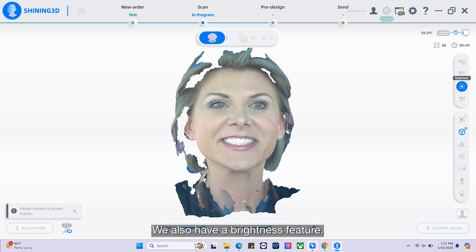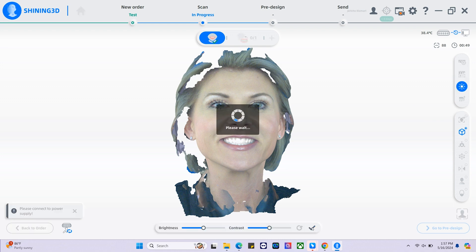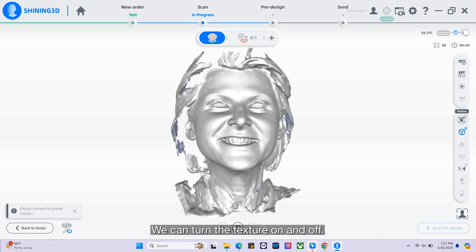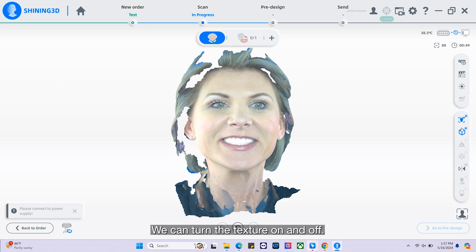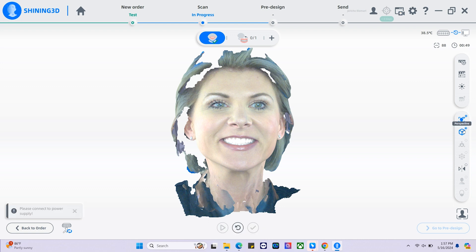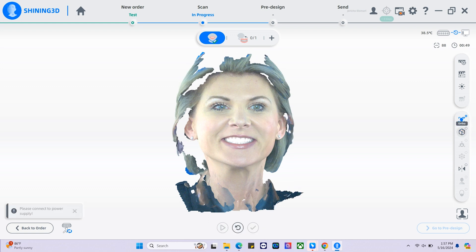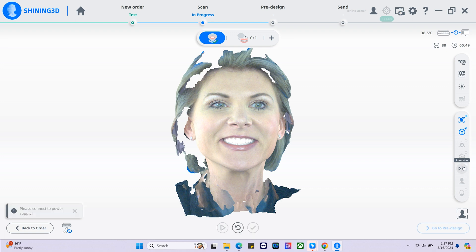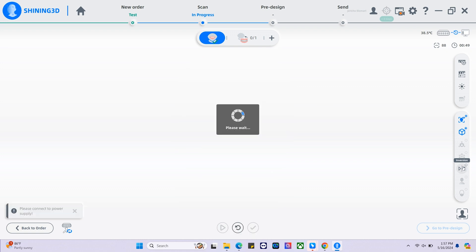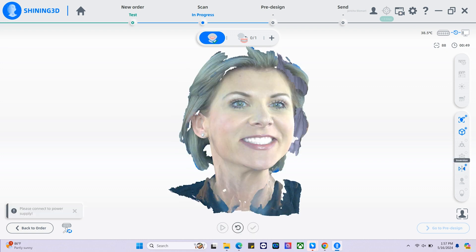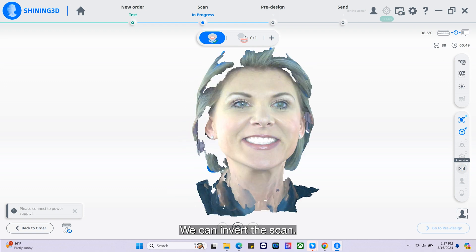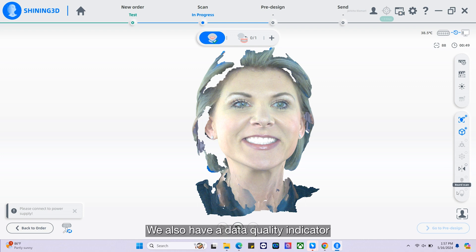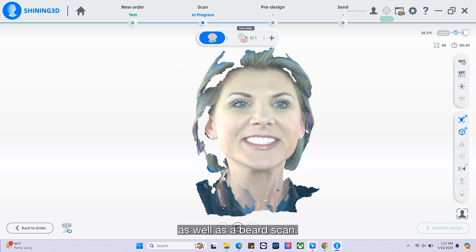We also have a brightness feature. We can turn the texture on and off. We can change the perspective. We can invert the scan. We also have a data quality indicator as well as a beard scan.